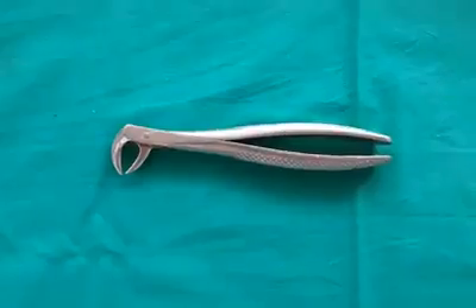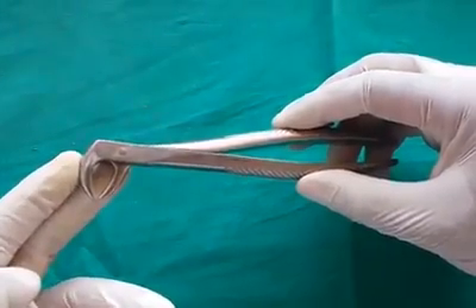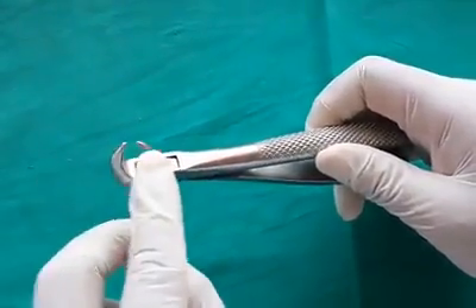Mandibular cowhorn forceps is also a single instrument for both sides. It is used in cases of grossly decayed teeth.